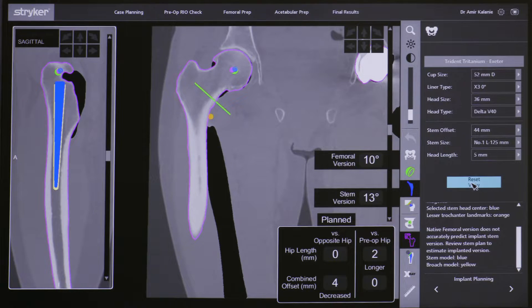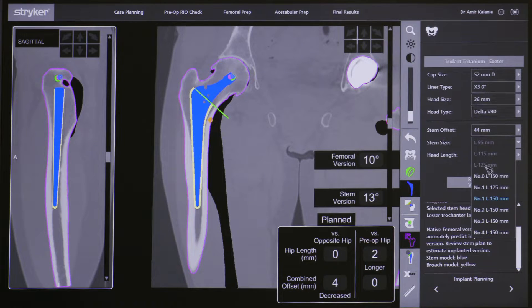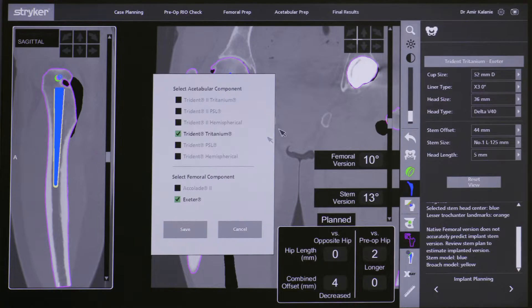I can also use different stems. Here I am trialing and planning the hip with a cemented stem, whereas before it was an uncemented stem. Depending on the patient's age and bone stock, I can individualize the type of stem that better suits them, which greatly reduces the risk of intraoperative or post-operative fractures of the femur — one of the key risk factors of hip surgery.